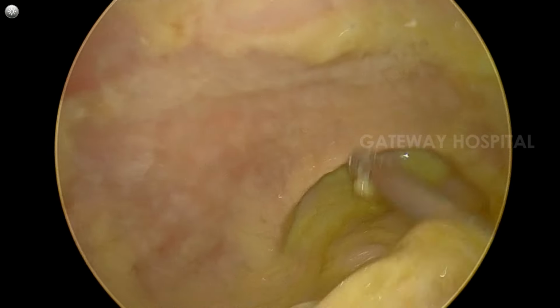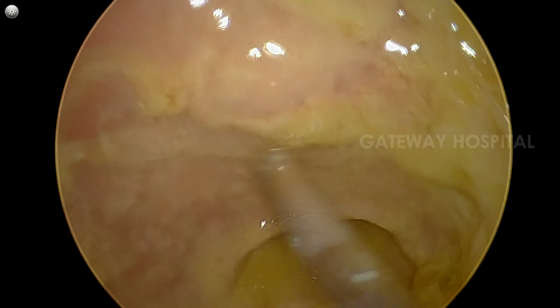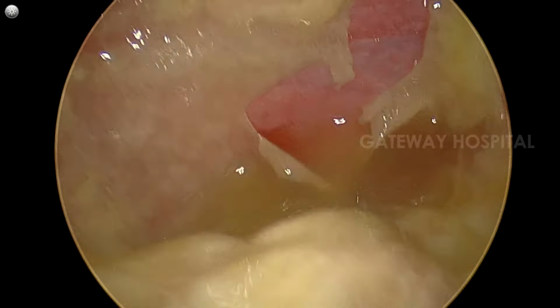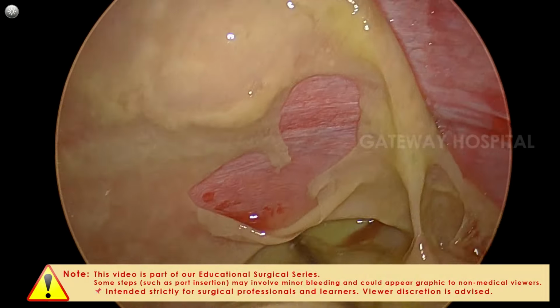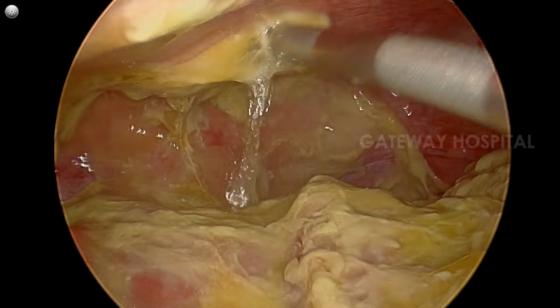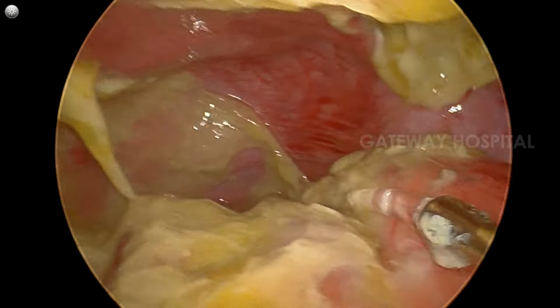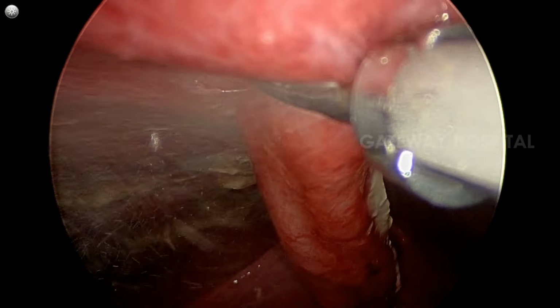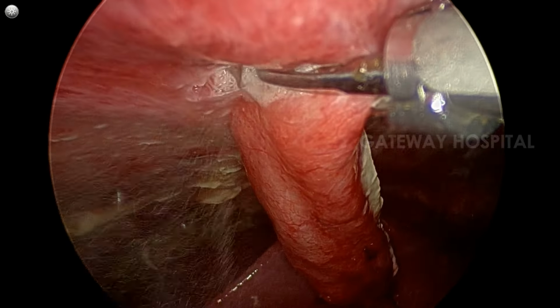So you focus on the right subdiaphragmatic space, right subhepatic space, left subdiaphragmatic space, and left subhepatic space. And if you come down, you focus on the right and left paracolic gutters, interloop collections, and pelvic collection. All these things have to be thoroughly washed and cleared.